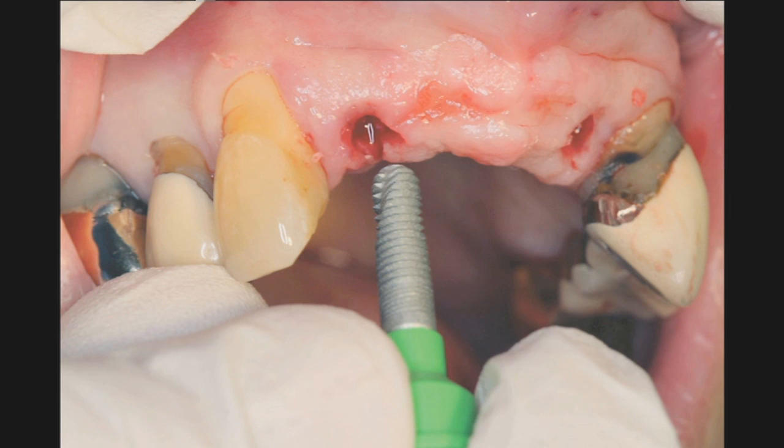So you can see these are self-threading implants, and we are undersizing the osteotomy site for our dental implant. So the site that we created is actually slightly smaller than the diameter of the final implant. So this gives us outstanding initial implant stability.